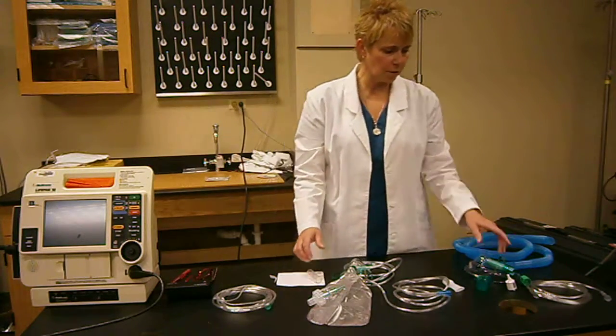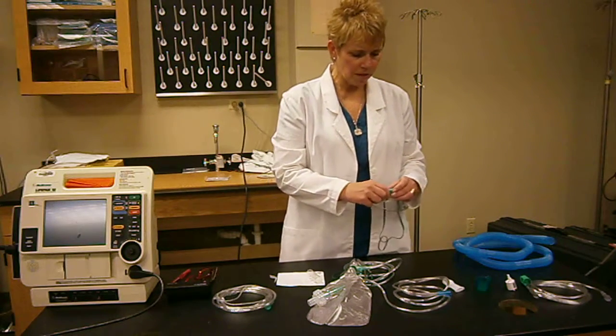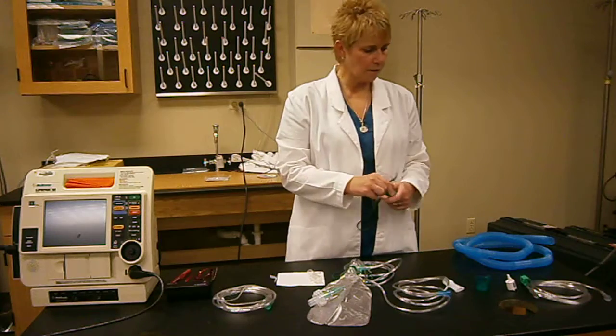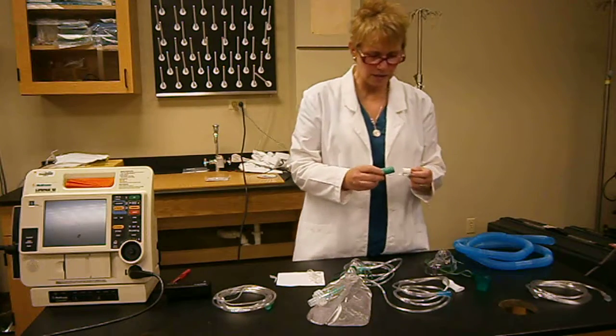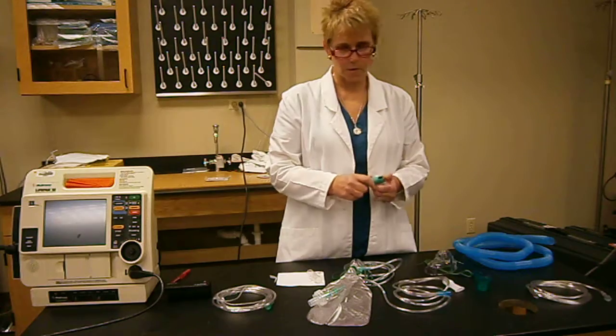I did want to take a moment to talk to you about the venti mask. So with the venti mask, you need to know that it comes in different parts, and you can titrate the oxygen levels based on, we're going to have to stop it.